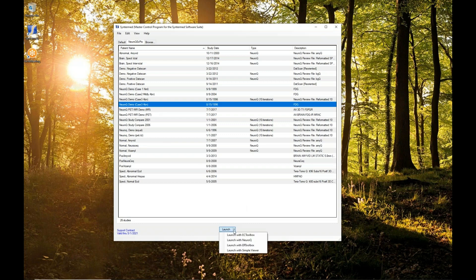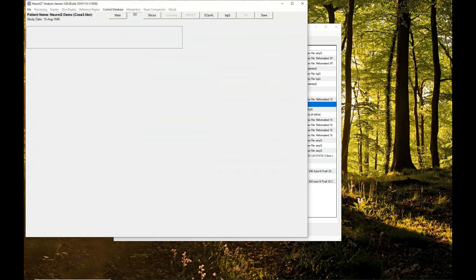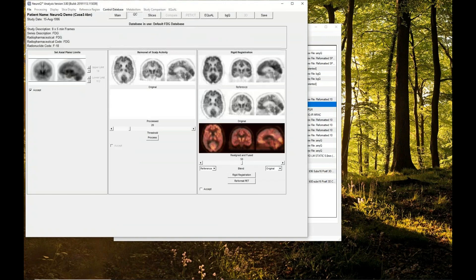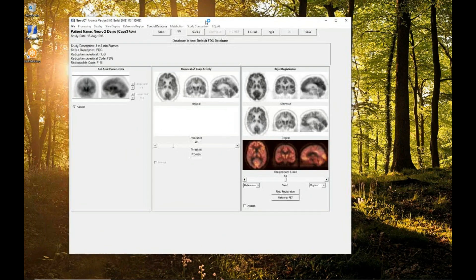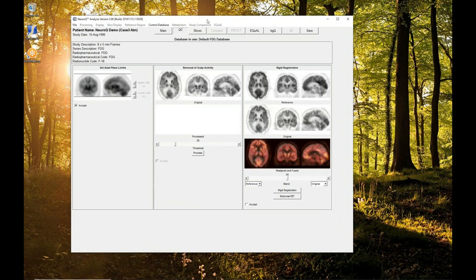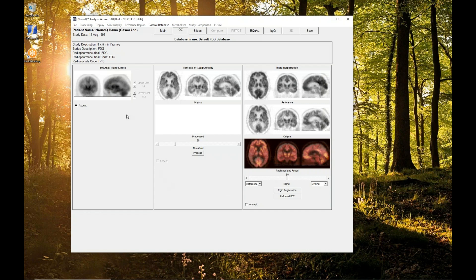Start this one from scratch so you can see all of the processing that goes into processing a NeuroQ study. This is the first screen that's going to come up when you launch data into NeuroQ. Regardless of what the data is, you'll always start off this screen.